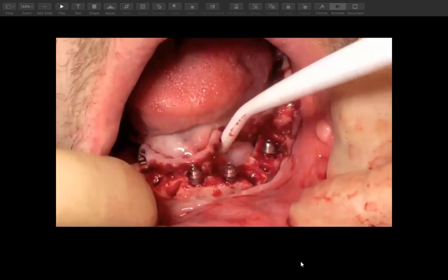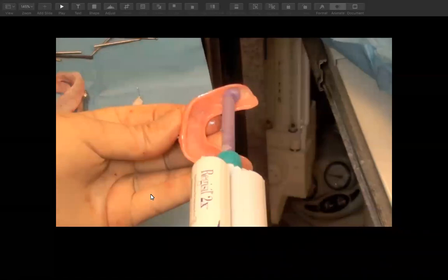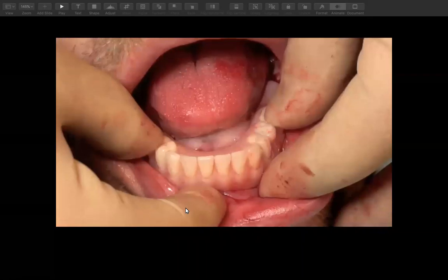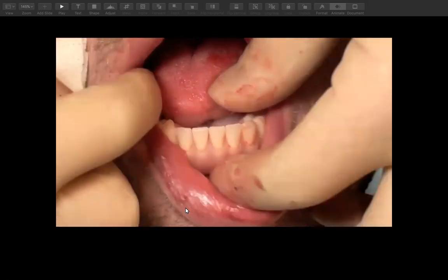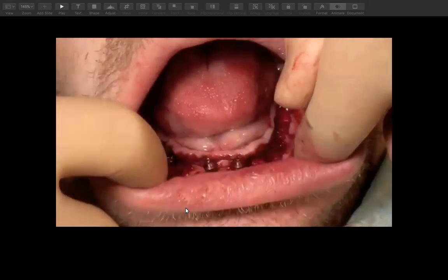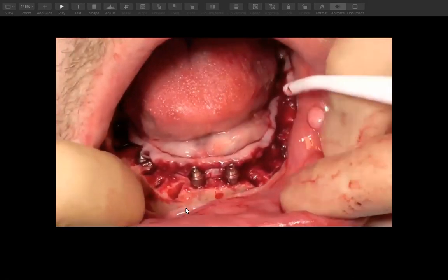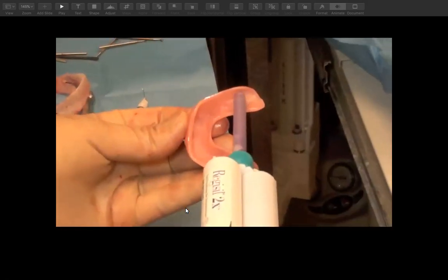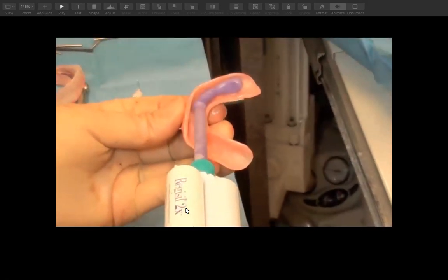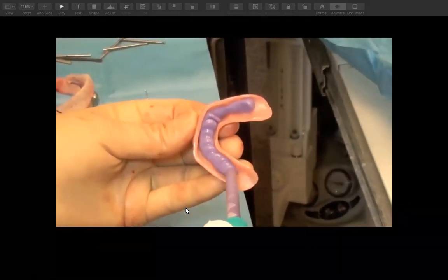There's just a little video here showing, again, kind of doing this wash. Sorry, I stopped that. Let me bring that back here for you. You can see this patient hasn't been sutured yet, obviously, so they are just checking the position. We're going to go ahead and do the wash. I can do the access holes just to get that ready while they're suturing.